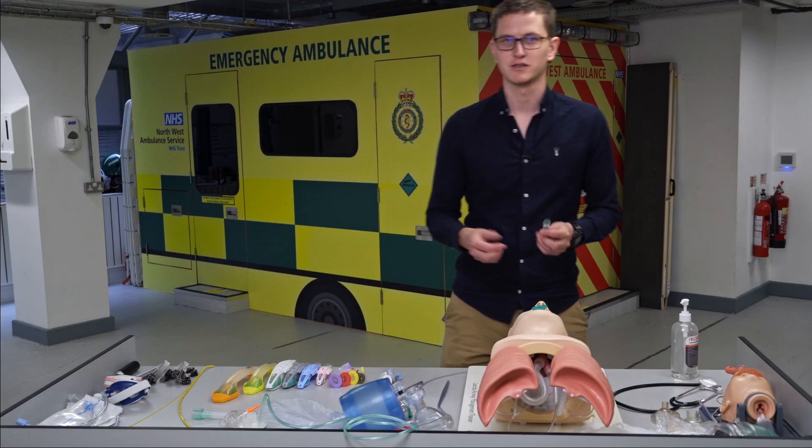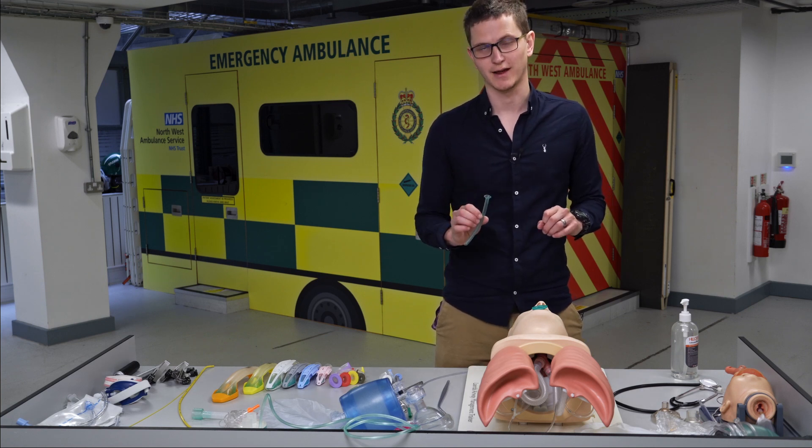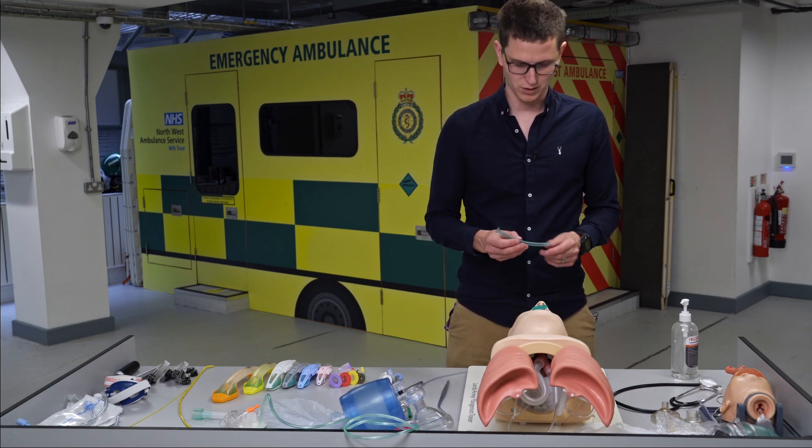What are the benefits of the NPA? It can be used in a conscious patient. It's not going to cause a gag reflex as long as it's not too big. The OPA cannot be used in a conscious patient because it will cause a gag reflex — and that's not what you want.